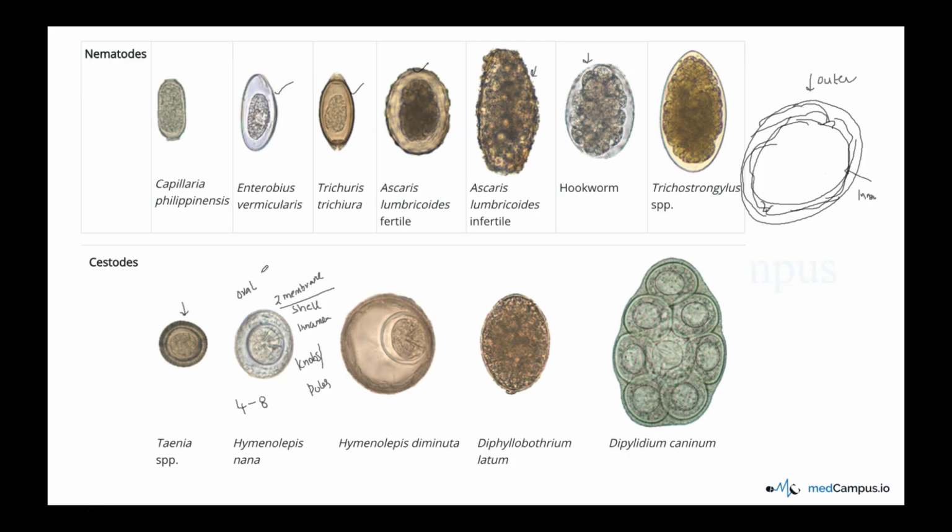It is colorless again. So the colorless ones which we have seen are hookworm, and this Hymenolepis nana is colorless again.